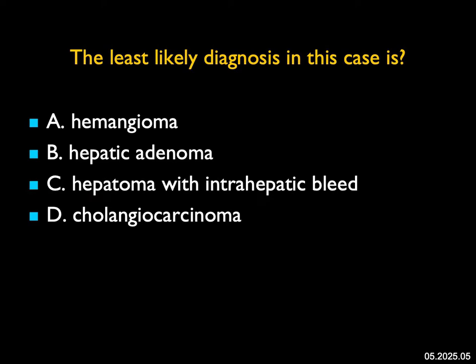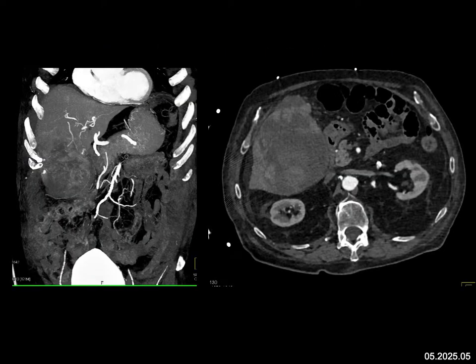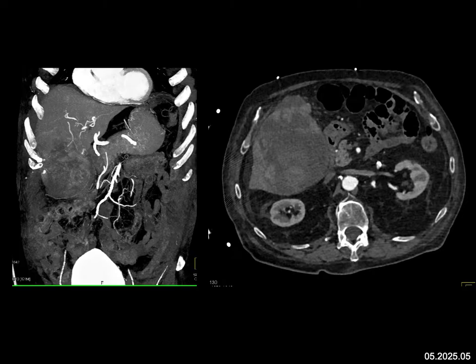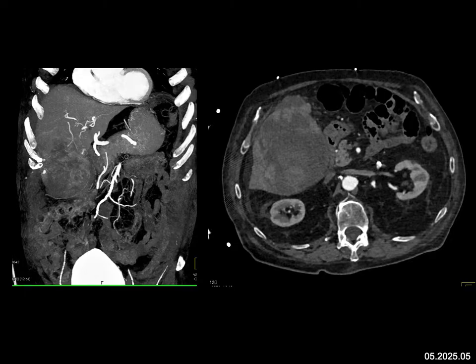The least likely diagnosis in this case: we see a large hepatic mass which has bled, with some irregular vessels present. The two lesions that bleed most commonly are hepatic adenoma and hepatoma. Hepatic adenomas can progress over time to become hepatomas. Looking at this mass with neovascularity and a bleed, I would say hepatoma — and in fact, this is a hepatoma. You could have considered hepatic adenoma. Cholangiocarcinoma is a possibility, but the least likely would be a hemangioma.